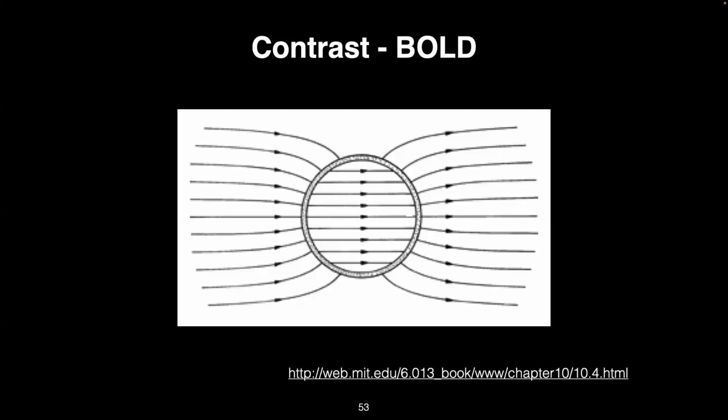If we're looking at what happens in brain tissue, and this cylinder here represents the cross-section of a blood vessel, and the surrounding is brain tissue. This schematic here represents what we'd like to think of as a non-active brain state, where maybe we're not doing anything, and there is an equilibrium level of deoxyhemoglobin in the blood vessel, and then the outside of the blood vessel is mostly water, electrolytes, what you think of as extracellular fluid.